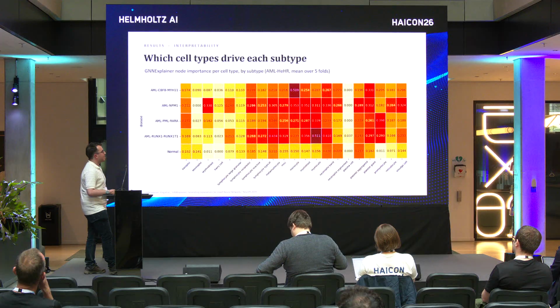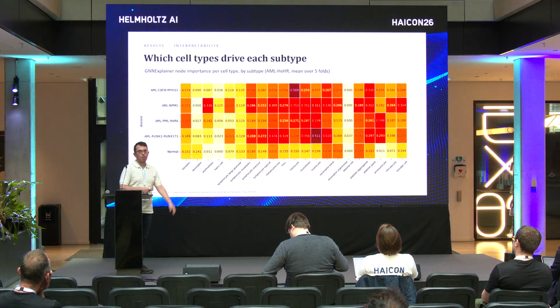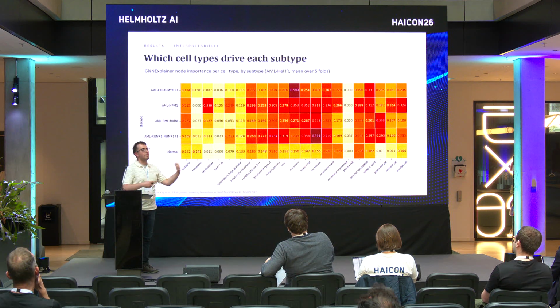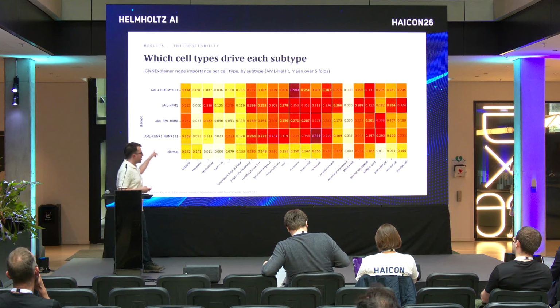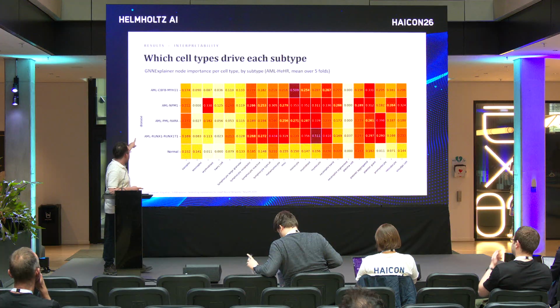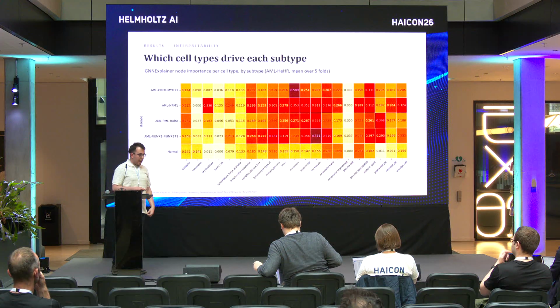And this is a GNN explainer result run on our learned graphs. And actually, it has very good results because, for example, for the first class, this mutation type, CBFB, is related to myelomonocytic leukemia, which means the monocytes are also high. And it shows that the monocytes are essential for the classification. And the same thing is true also for PML-RARA, which is a promyelocytic leukemia.